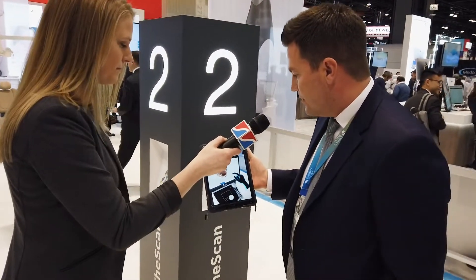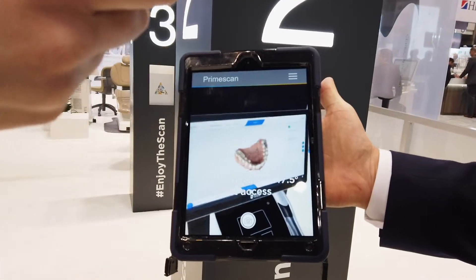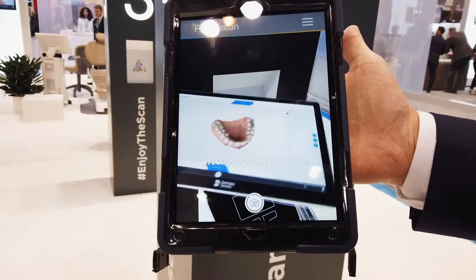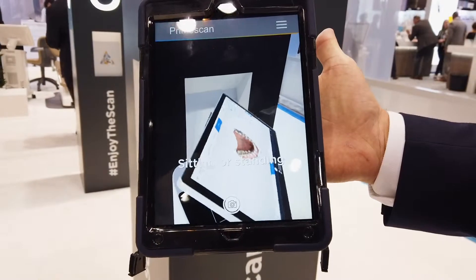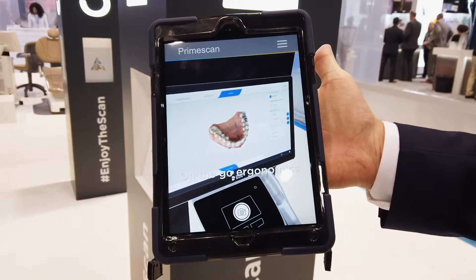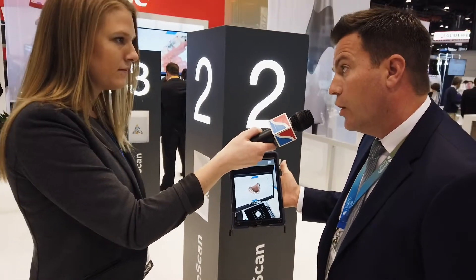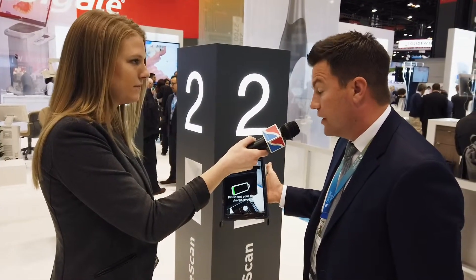PrimeScan is a completely unique digital impression scanner in terms of ease of use and the way that it works. Clinicians can use it sitting down or standing in the operatory. You've got 270 degrees of swivel on the unit, a touchscreen display, and on-the-go ergonomics. We have an all-day battery that allows a clinician to charge it overnight and then use it the whole day with no need to recharge until lunchtime.